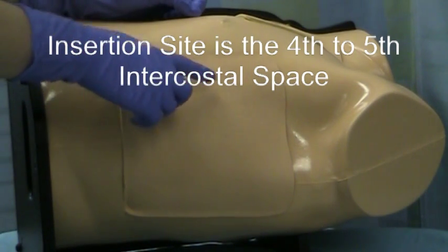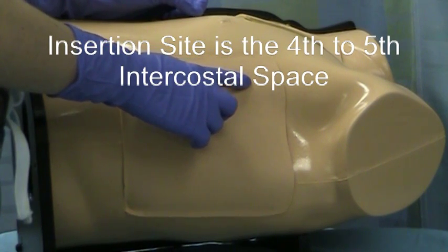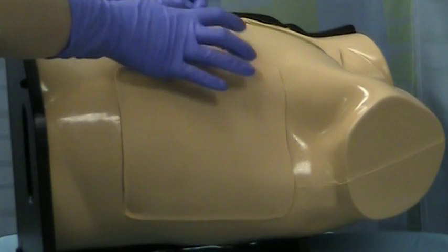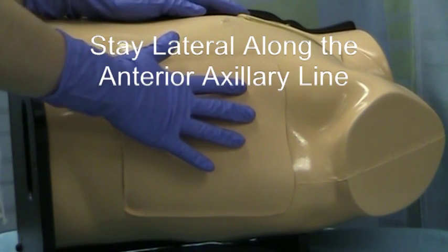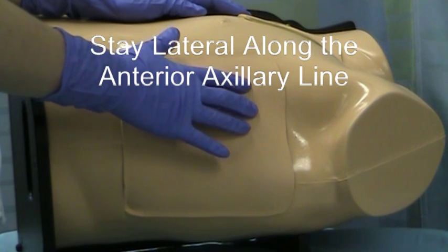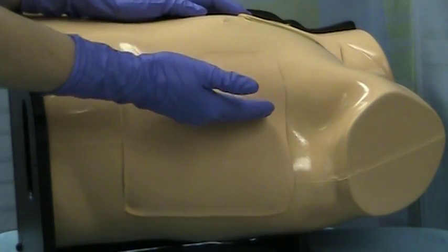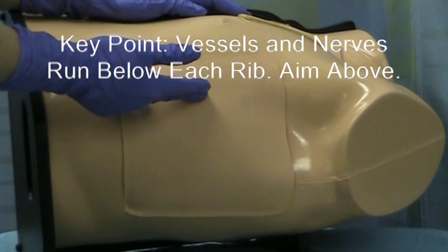We like to place a chest tube somewhere between the 4th and 5th intercostal space, which on a male patient generally coincides with in line with their nipple. However, obviously in female patients you can't use this anatomic landmark because it won't be in the same place. And we also try to do it somewhat lateral so that we're usually about in the anterior axillary line.